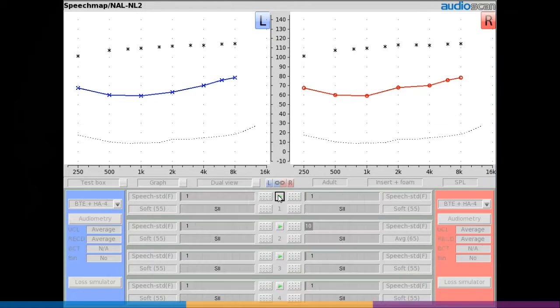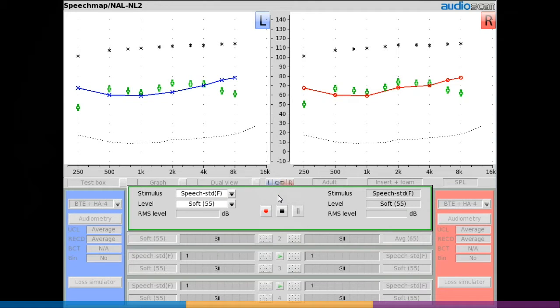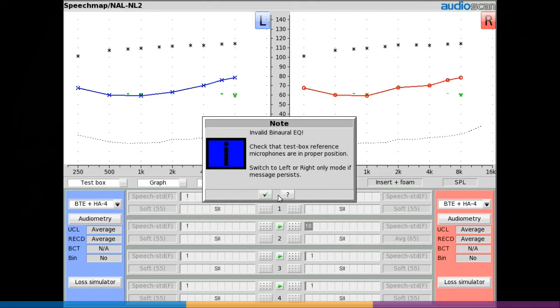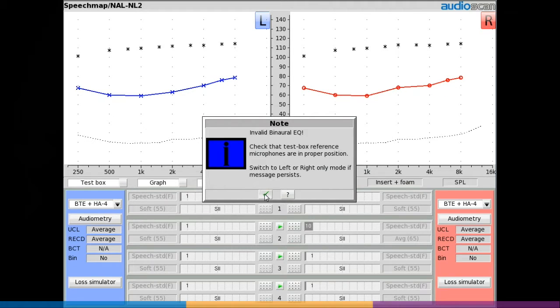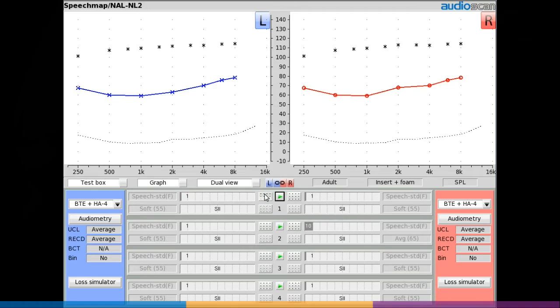If a mismatch in instrument positioning in the test box is detected, meaning that the reference microphones are not equidistant from the front speaker, the user will be warned to reposition before making simultaneous binaural measurements.